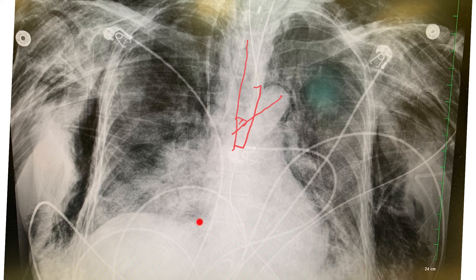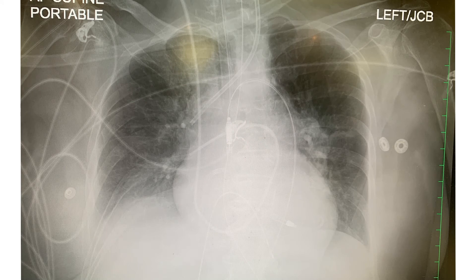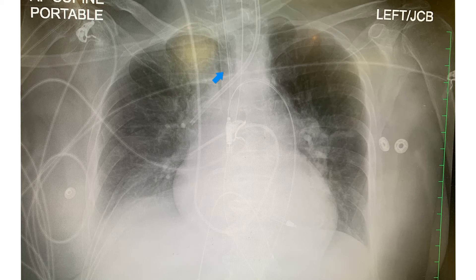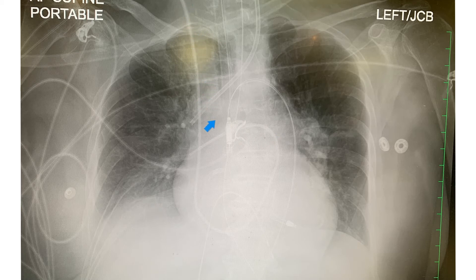This x-ray looks much better. The carina is below this opaque material; the right main stem is here and left main stem here. The ET tube tip is right here and the carina is right here — barely two centimeters, so to be safe I'd pull it up by one centimeter. On the side there's a Swan catheter going through the right IJ into the right atrium, right ventricle, and into the pulmonary arteries. There also appears to be an impella device with its tip in the left ventricle.